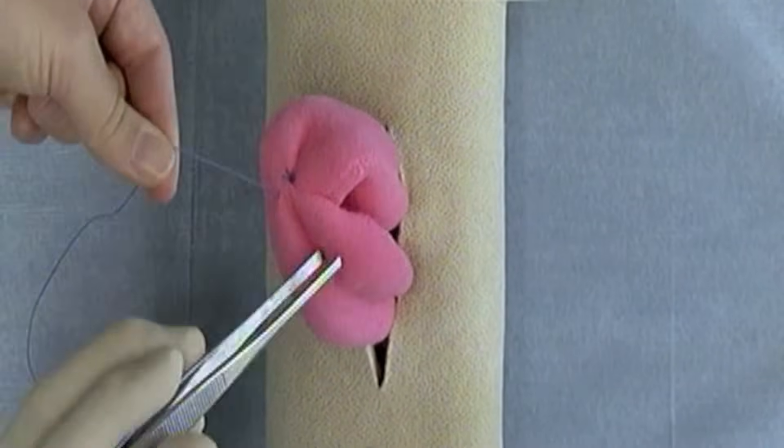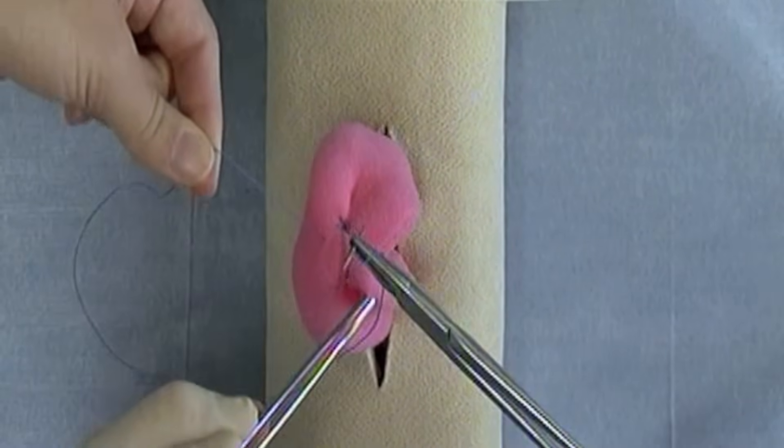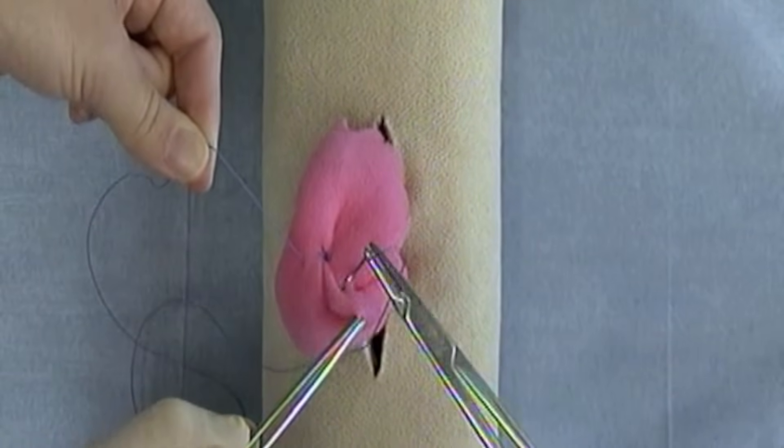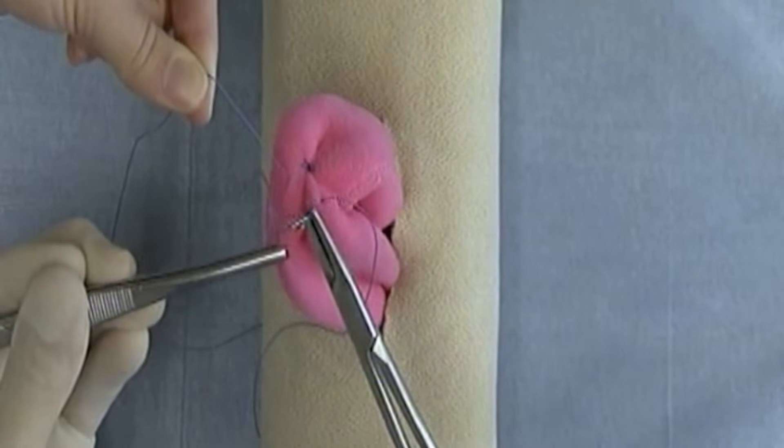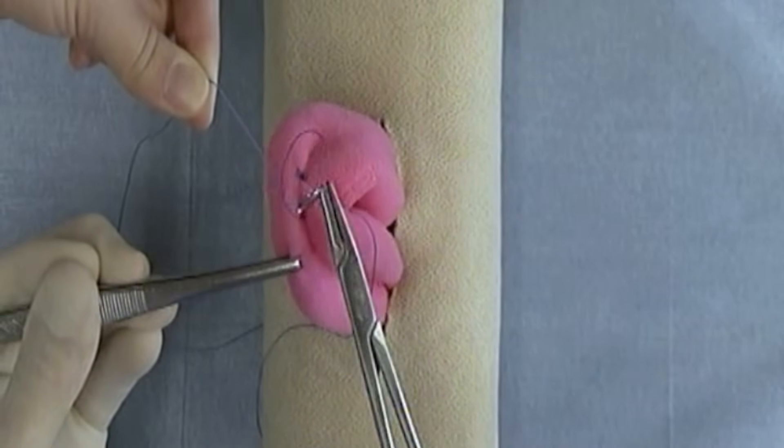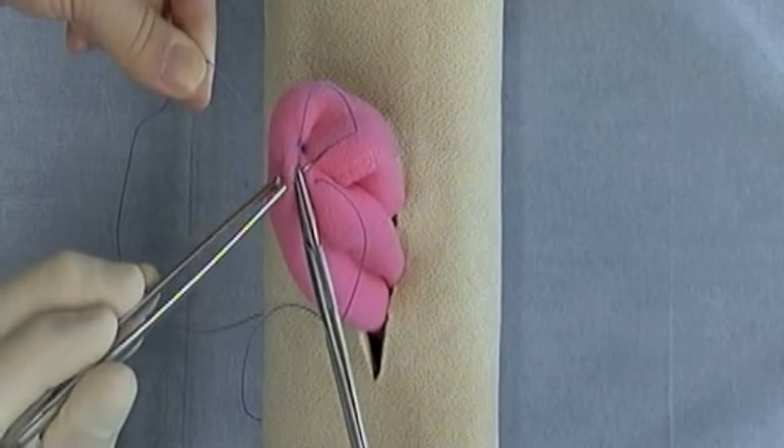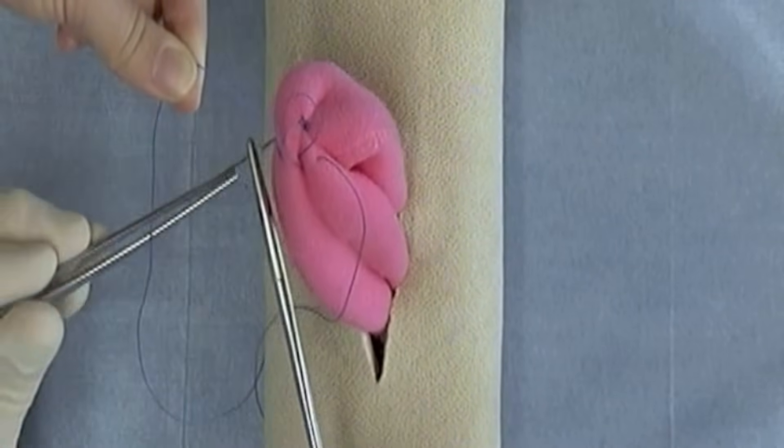Okay, and we'll take a few more bites just for practice. I'm deliberately trying not to penetrate the lumen.